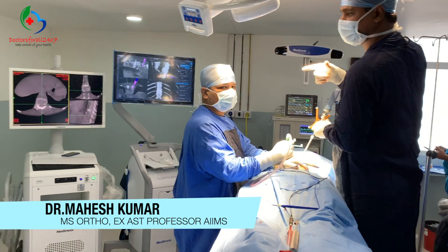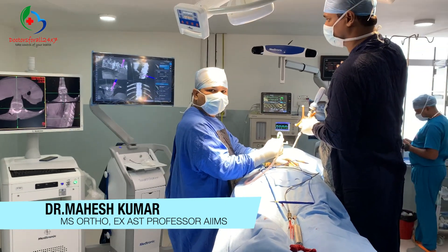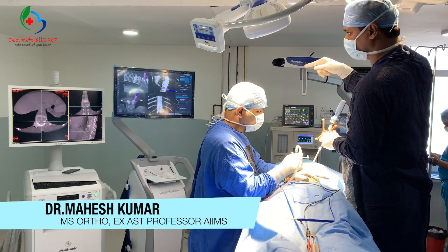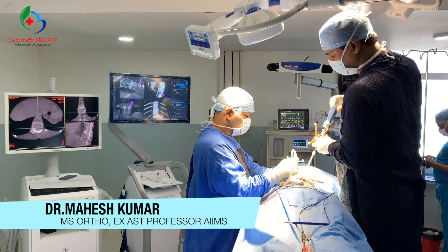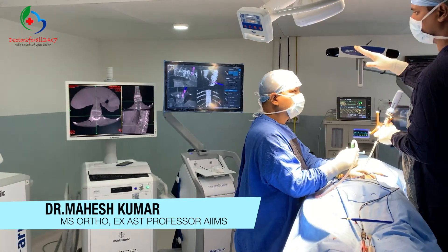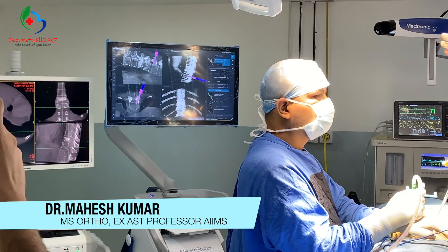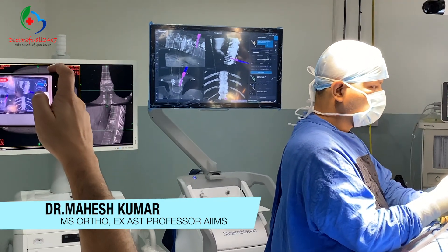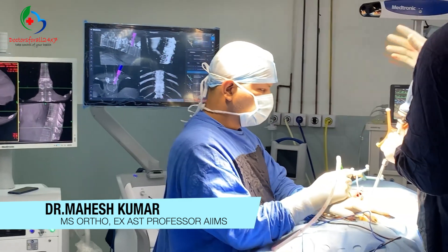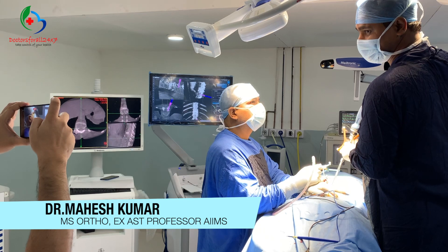The O-Arm image has been taken and transferred to Stealth Navigation. What we are doing now, under image control and three-dimensional control, is putting in the particular pedicle screw. As you can see, it is accurately placed — there is no margin of error. It's a completely safe way to place the pedicle screw with safe instrumentation. That is the magic of O-Arm with Stealth Navigation.